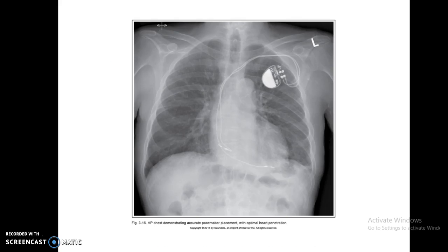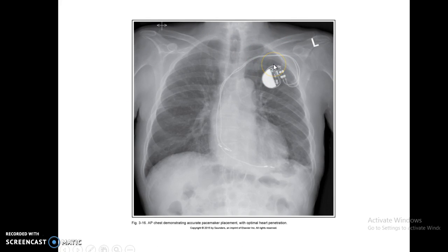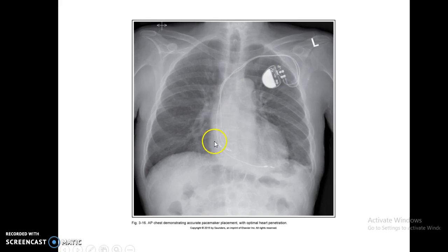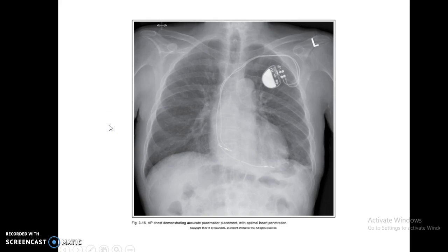Pacemakers — you're going to see pacemakers quite a bit. They are usually going to be on the left side, up towards the top third of the lung. You're going to see two wires coming across, going over to the opposite side, and the electrodes are going to be in the different parts of the heart. You want to have a little bit more heart penetration when you're doing pacemakers.